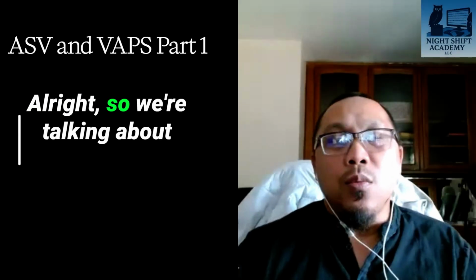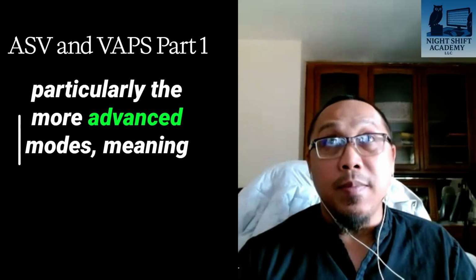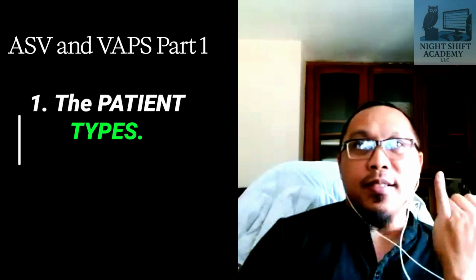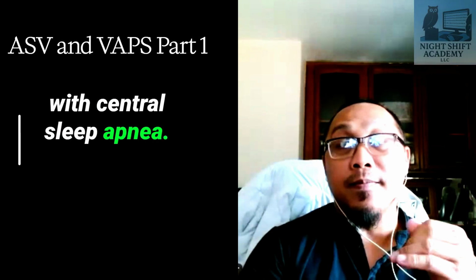All right. So we're talking about modes, particularly the more advanced modes, meaning to say your volume-assured pressure support versus ASV. Okay. So what are the differences? When you think about it, the main difference between these two is, one, the patient types. Why? ASV patients are those with central sleep apnea.